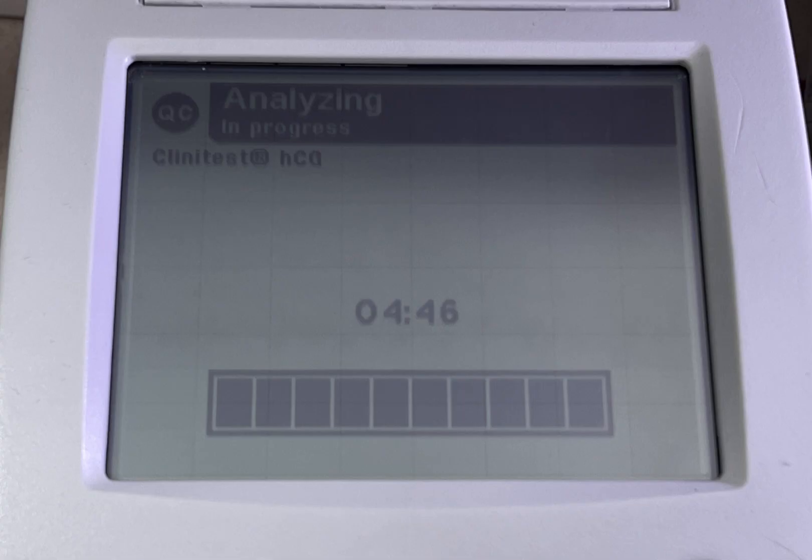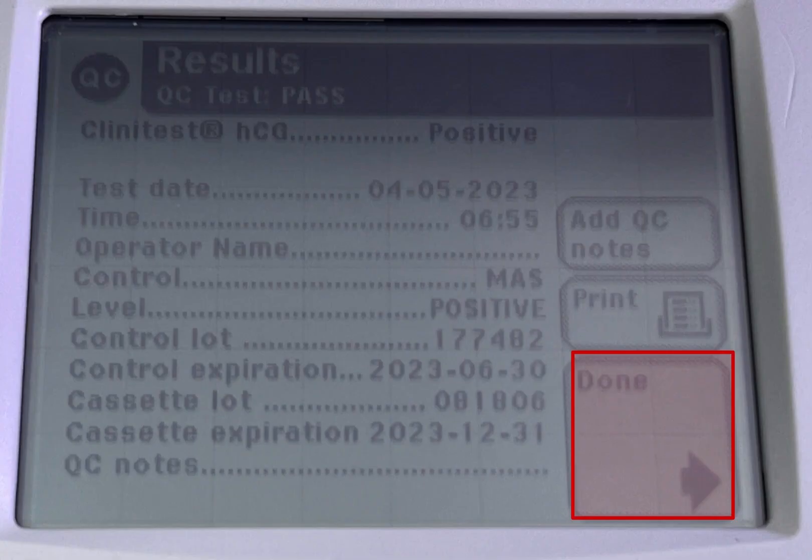Click start. It takes about 5 minutes to result and pass. Once passed, click done.